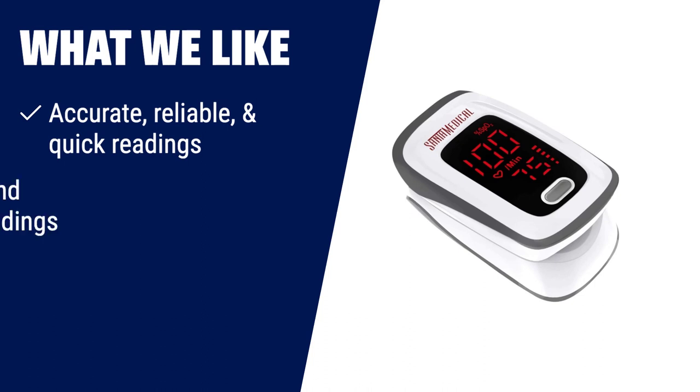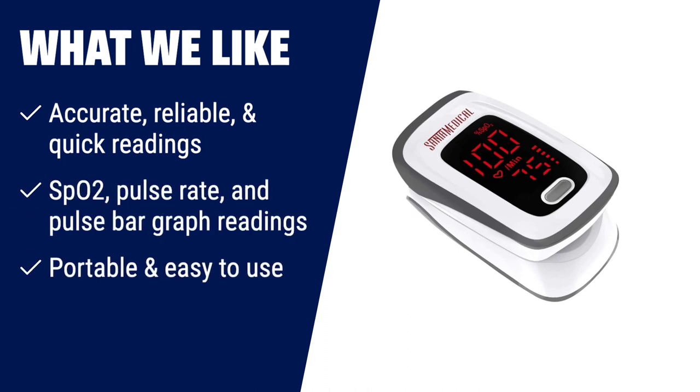What we like: if you need accurate and quick readings of your SpO2, pulse rate, and pulse strength, this fingertip pulse oximeter is the perfect choice. Its large digital LED display and simple bar graph make it easy to read and understand your results. Whether you're at home or outdoors, this portable pulse oximeter is lightweight and compact, making it easy to carry wherever you go.